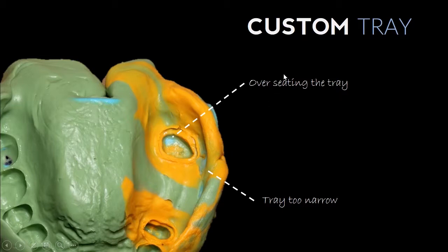One of the other advantages of making a customized tray is that you can have an even thickness of material that covers the teeth and anatomical features of the mouth.